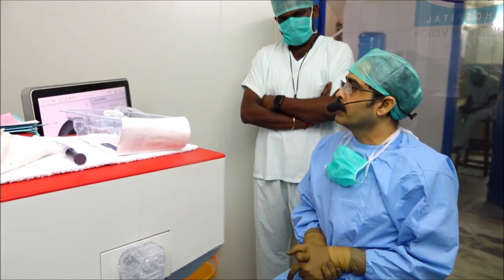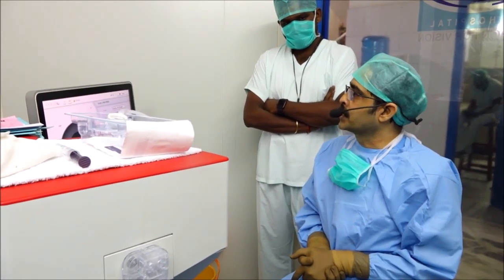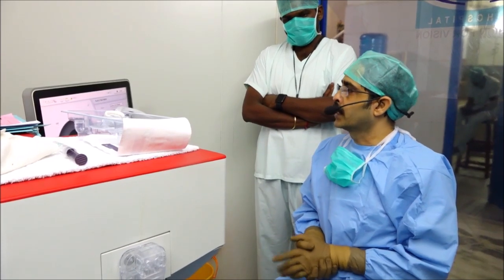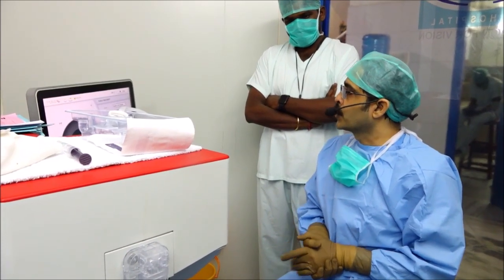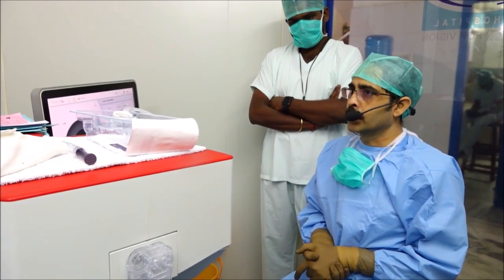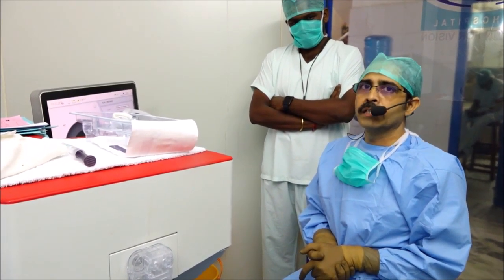We just keep the femto laser machine — the Catalys by Johnson & Johnson — in an adjacent room, which is a clean room. It is not essentially a sterile room.